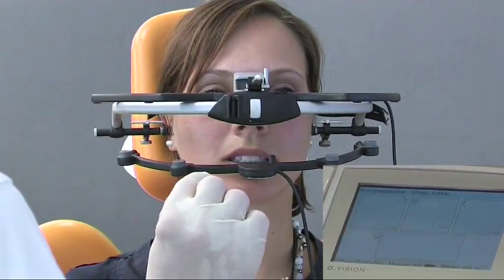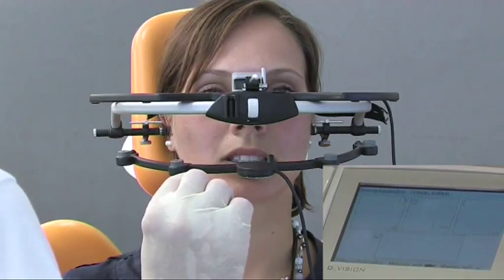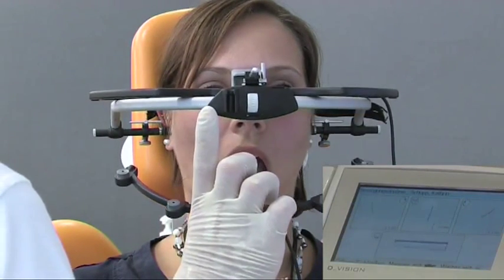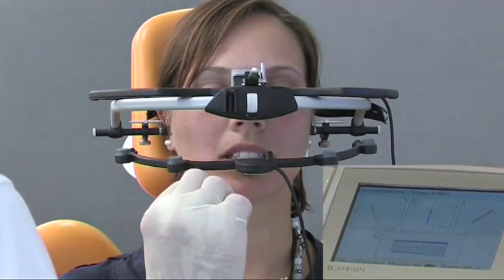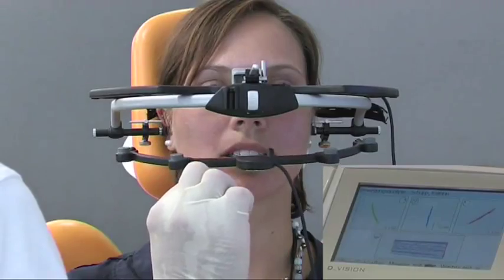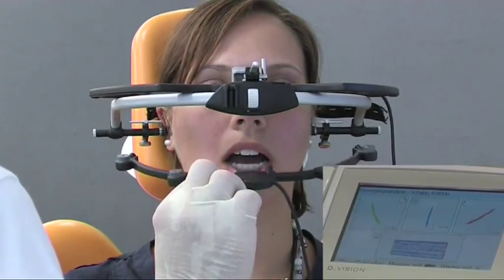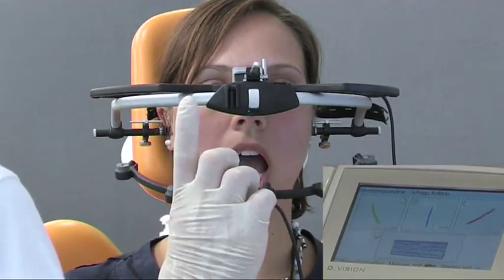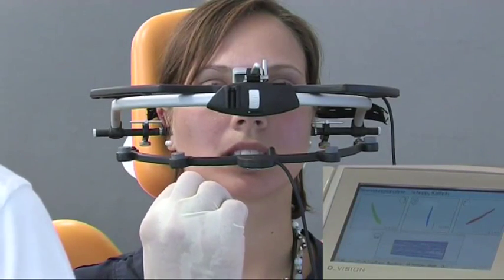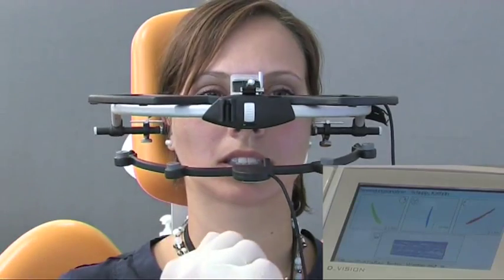As initial movements, several opening and closing movements are recorded. Please open and close several times. The measurement is ended and stored by pressing the OK key.